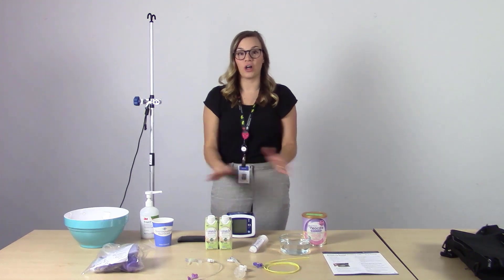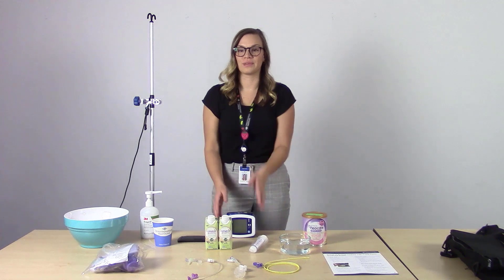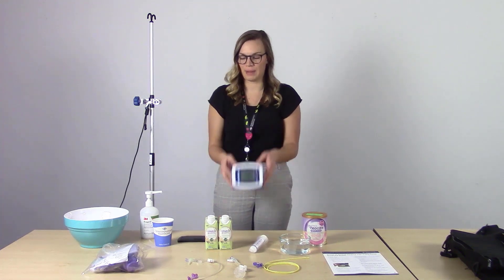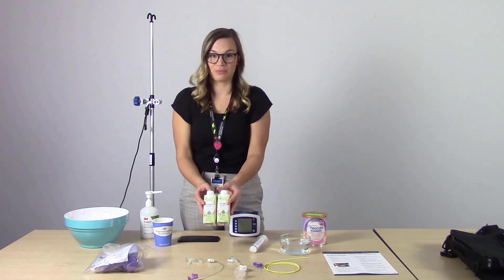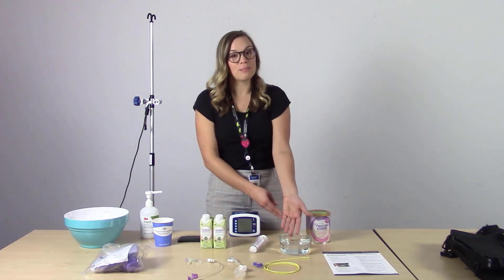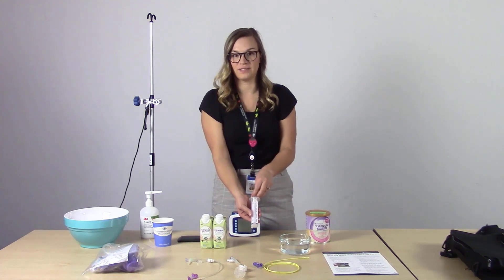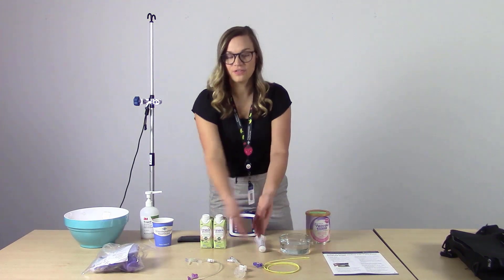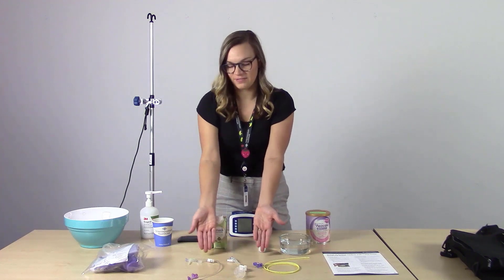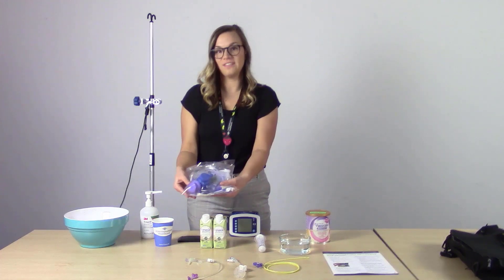First, collect all the supplies necessary to give yourself an enteral feeding: the Kangaroo Joey Pump, your formula — which may be ready to feed or powdered — a bowl or cup with very warm water, a 60 ml syringe used for flushing, your feeding tube which may look like any of the following, and the bag set with both the Feed and Flush Bag.